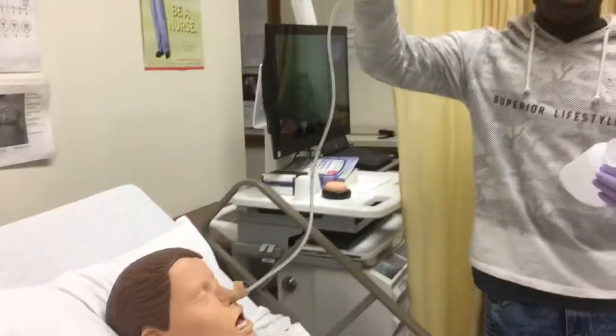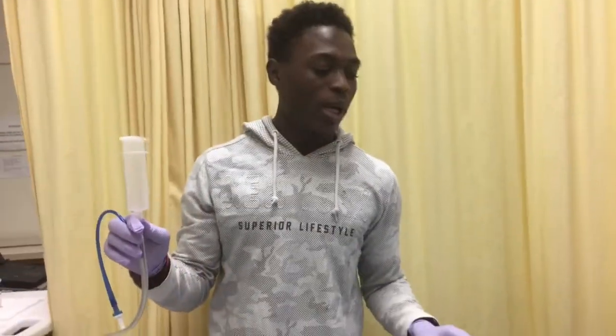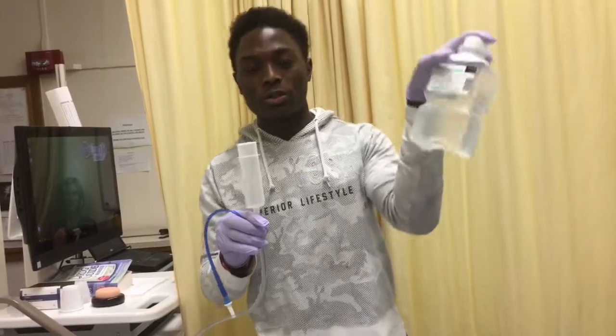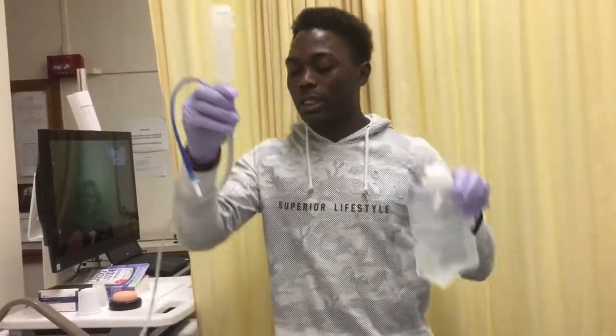and make sure they have all that food that came out, plus the food that the doctor ordered, you want to give it to them too. And every time you do that, you want to flush the tube, so you can use water or a normal saline. In this video, I'm going to use a normal saline solution. So I am going to put the water in here, and there we go.